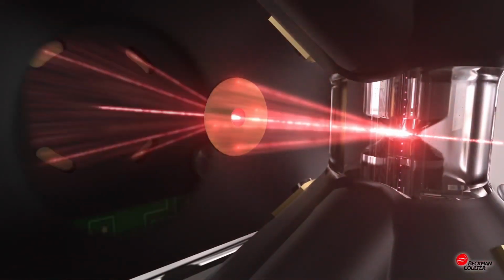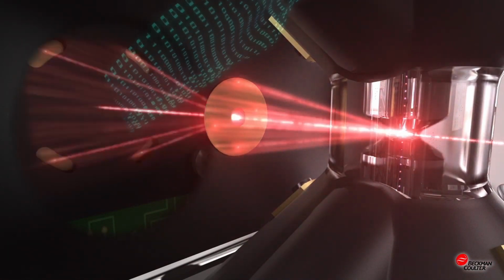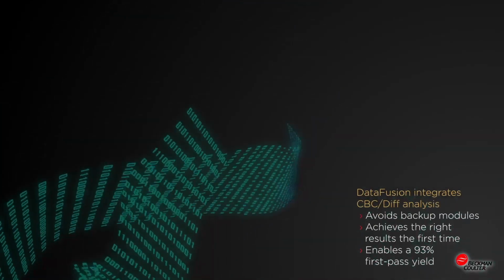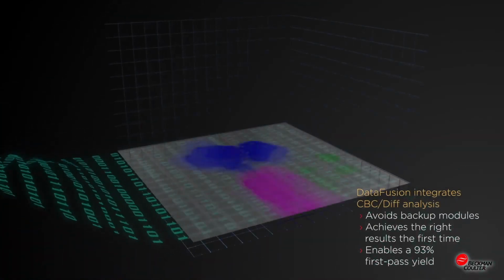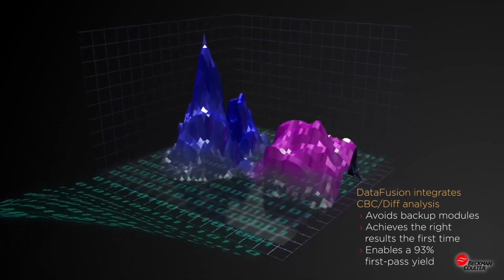During this, a laser is directed at them, and the scattered light is measured at multiple angles. The absorbance is also recorded. The cell can be identified based on the intensity of the scattered light and the level of absorbance. A 5-part cell counter can differentiate all WBC types: neutrophils, lymphocytes, basophils, eosinophils, and monocytes.